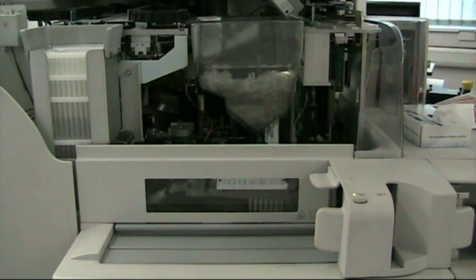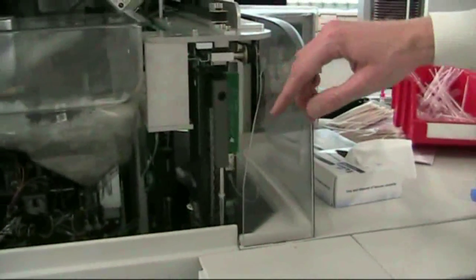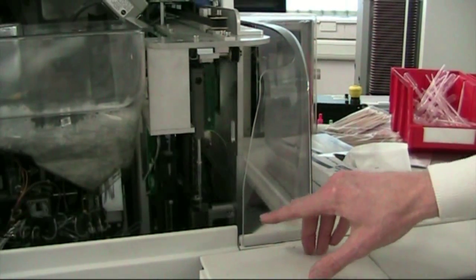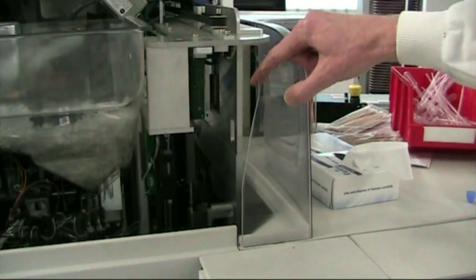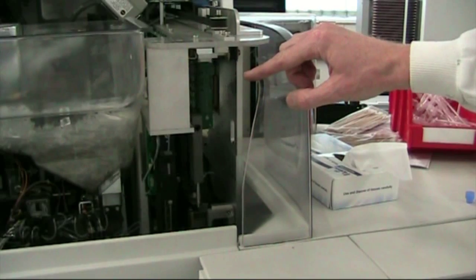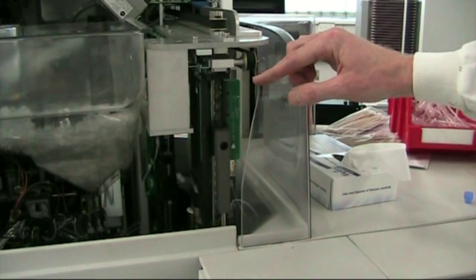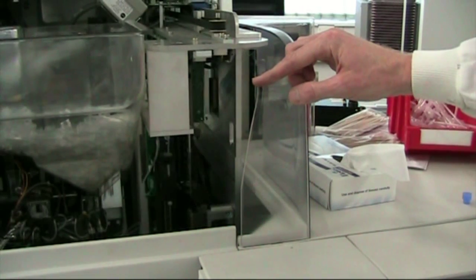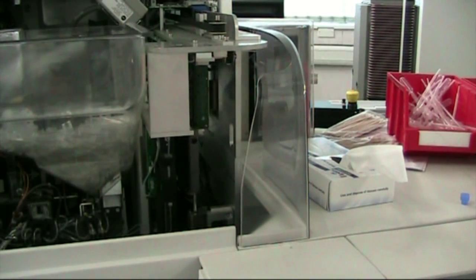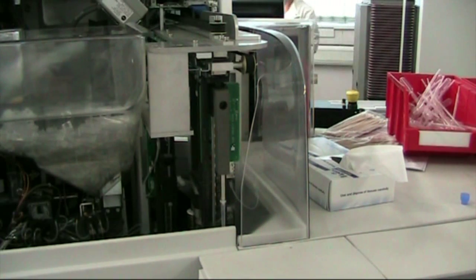It's actually now taking a pipette tip and going into the sample. There's a small amount of sample being placed into the plastic cuvette. Now it gets rid of the cuvette tip and takes another one for the next test. It puts it into the plastic cuvette — so it's a separate plastic tip for each test, and a separate cuvette for each test.